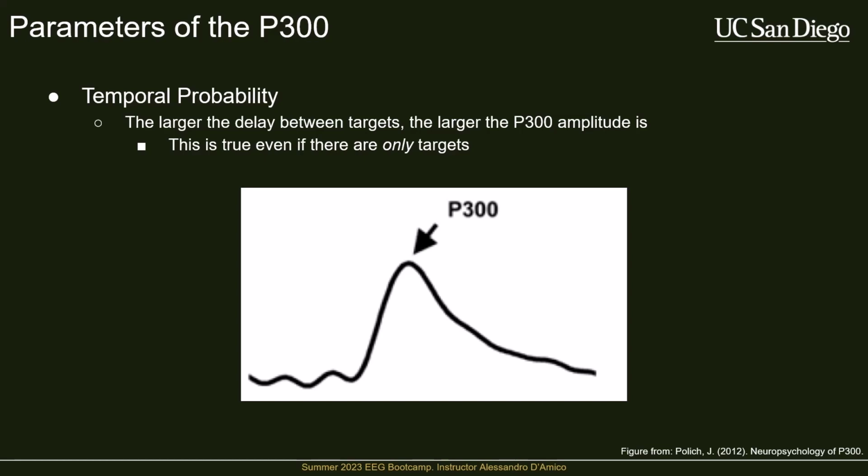Yeah. Real quick, does the P300 spike happen after target? It's like after they see target? Yes. Yeah. Yes. Sorry, I couldn't have made that more clear. But yeah, so you'll see the P300 about 300 to 400 milliseconds after you see the target stimulus.